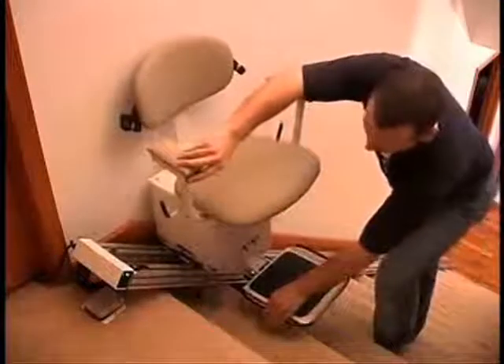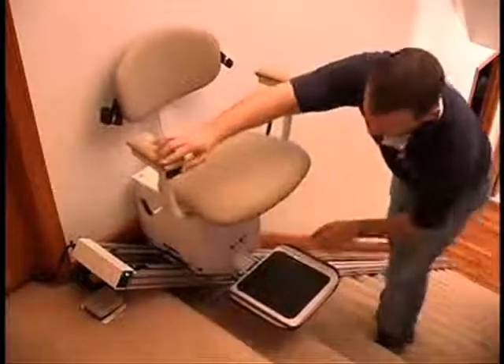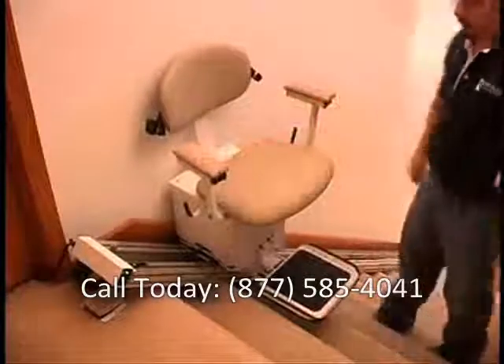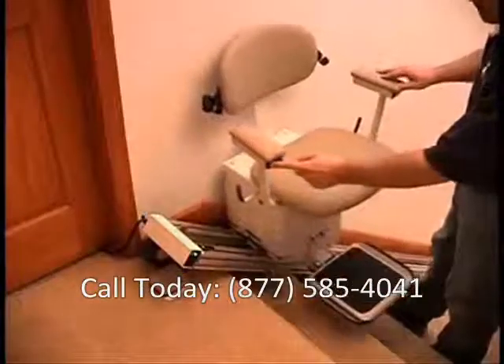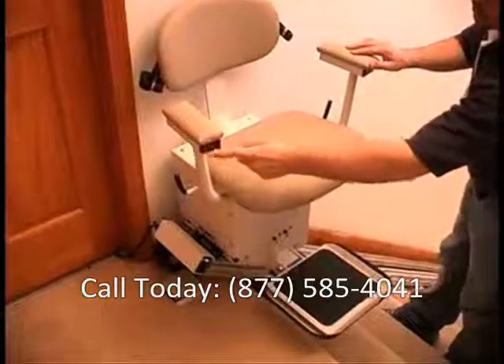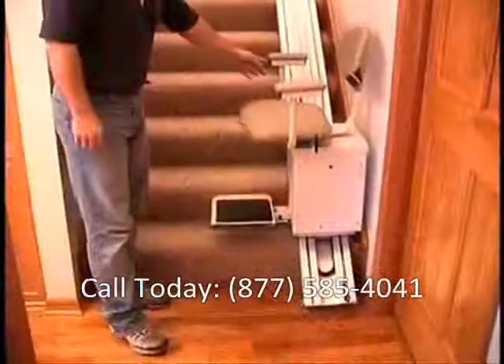Check to make sure the footrest safety is working. If it comes in contact with an object, the unit will not run until the object is removed. Check to make sure the upper limit switch works. Then, check the lower limit switch.